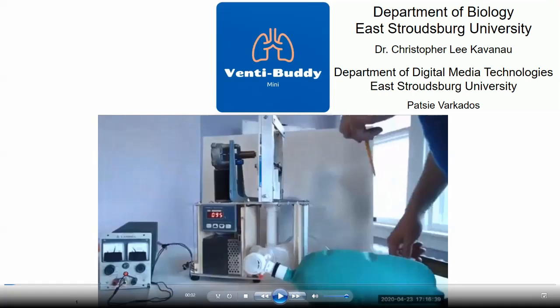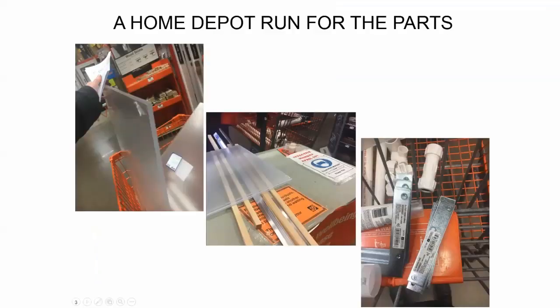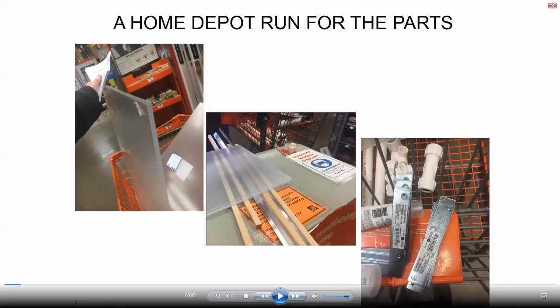We are doing what we can to help address the profound shortage of these life-saving devices amid the COVID crisis. Here is the latest version of our ventilator, which I just finished building a few days ago. The ventilator designs I'm focusing on are simple, cheap, and most importantly, they of course need to work. Simplicity in its electrical and mechanical design allows for emergency repair in the field. It also means, all other things being equal, less can go wrong.